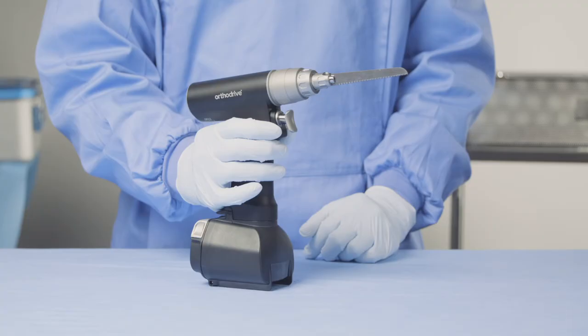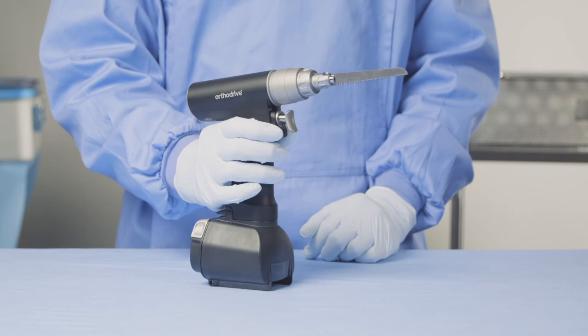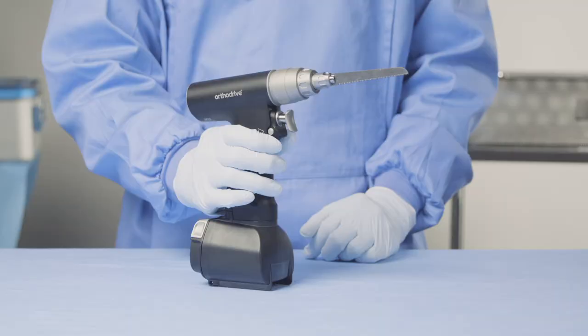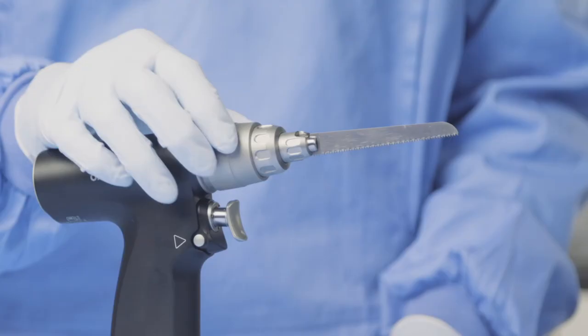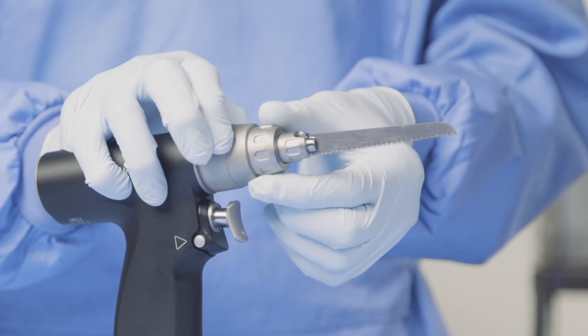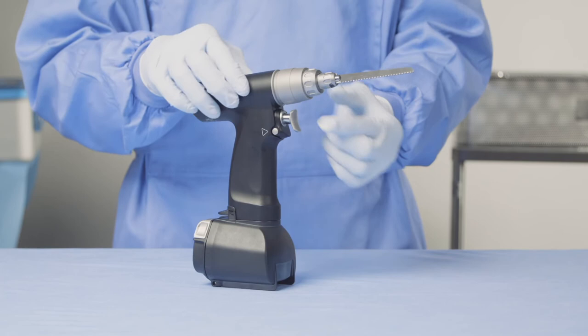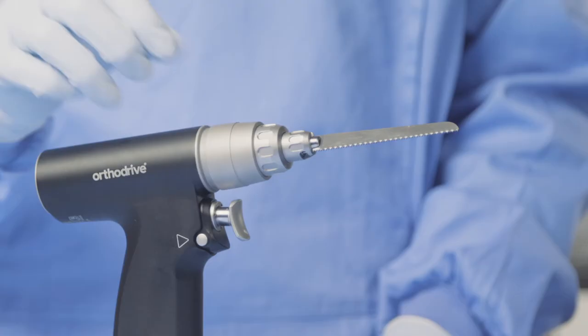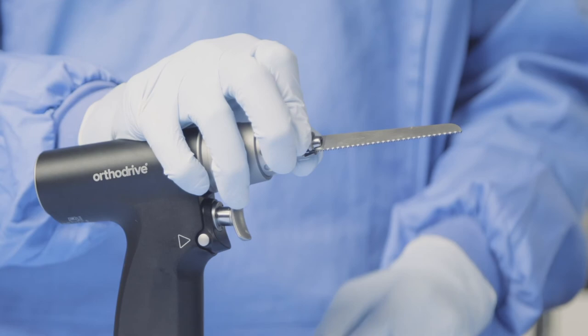Another nice feature of the DBC 700 is that I can adjust the angle of the blade. Firstly, I'll place the tool back into safe mode, and now I can adjust the angle by simply pulling back on this collar here and twisting to the desired position. This makes the reciprocating saw highly versatile. To remove my S84 blade, I'll simply twist the small collar at the front of the tool and slide the blade straight out.